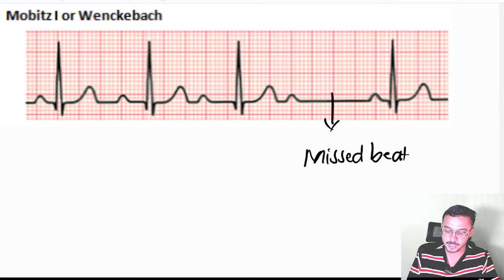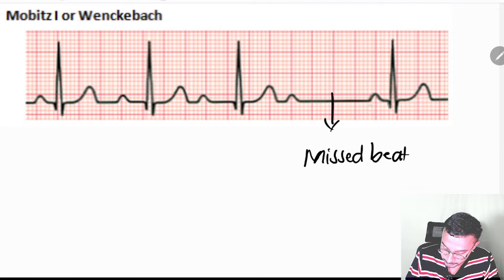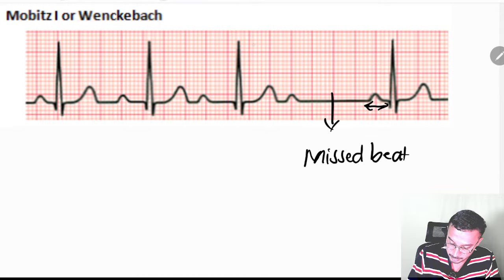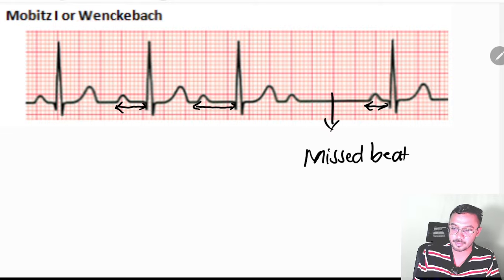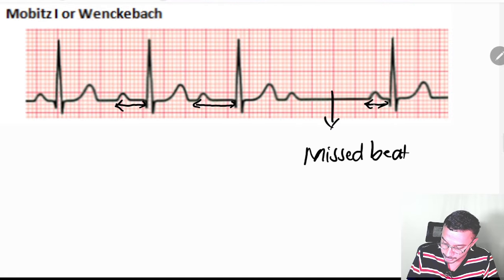In Mobitz 1, look at this PR interval, after and before. This is the PR interval. Look at the duration of the PR.